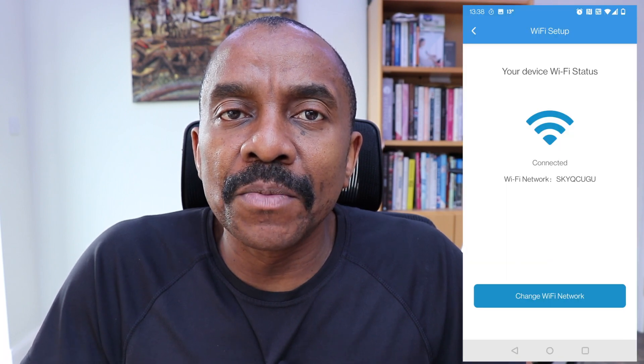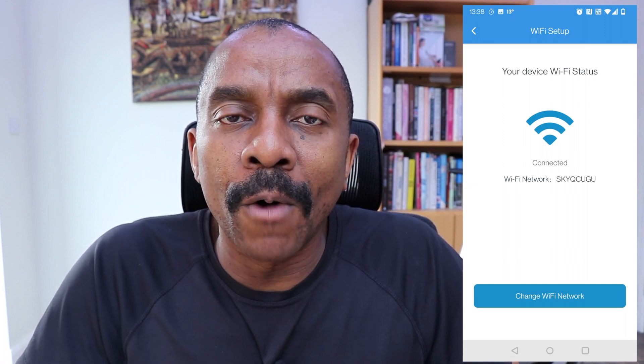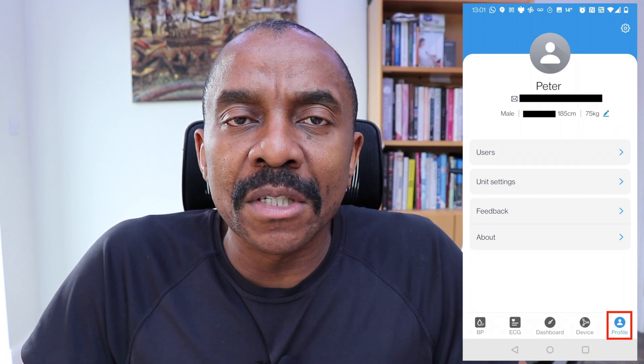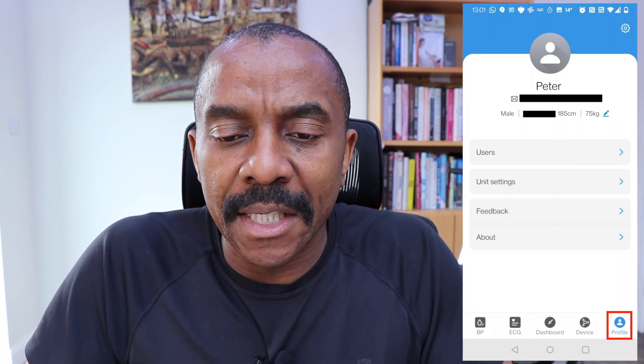The app also gives you the capability to connect with the blood pressure monitor either using Bluetooth or Wi-Fi — both are great options. The final icon at the bottom of the screen is the profile icon, where you can register as many users as you want to use this particular blood pressure monitor, and the screen looks like this.